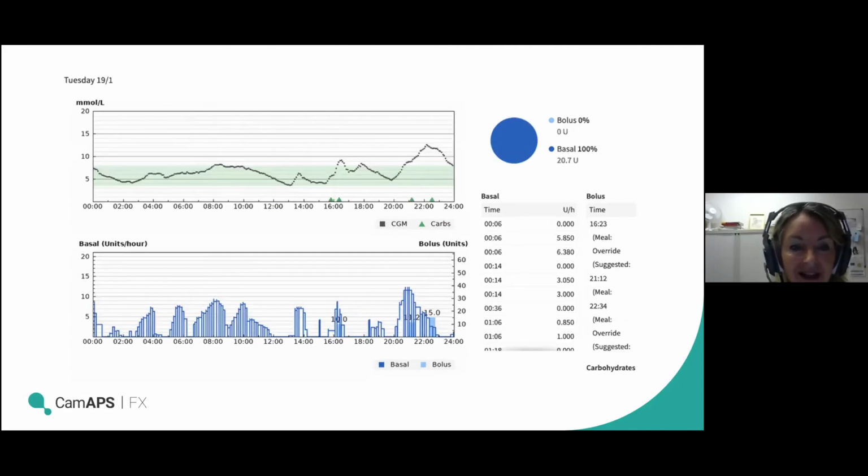And then I think on the next slide we have that. So nice and stable glucose levels through the night. You can see the system's working hard to do that. And then she delivered yesterday by a planned cesarean, 37 plus 5. And you can almost tell the timing. So her cesarean section was at 8 a.m. yesterday morning. Usually you will see a little bit of a rise in glucose levels in the immediate operative phase, and then nicely managed to avoid any hypos, and then stayed on the system throughout.